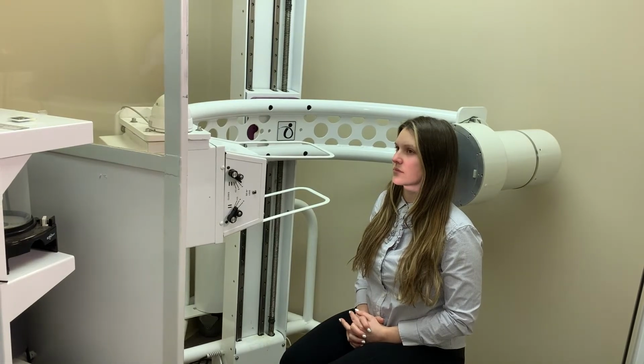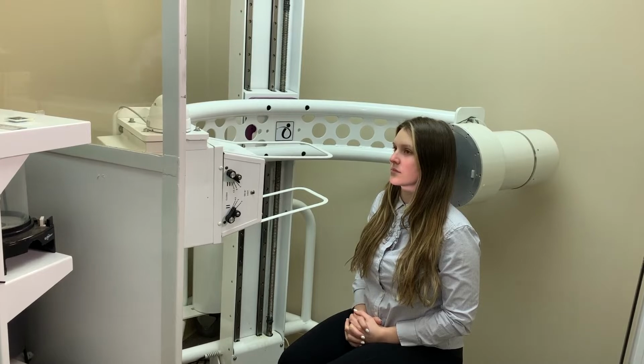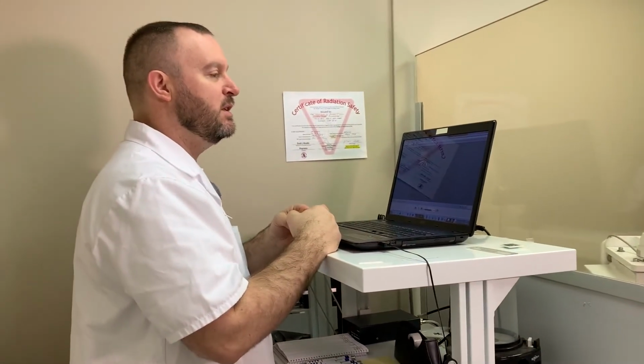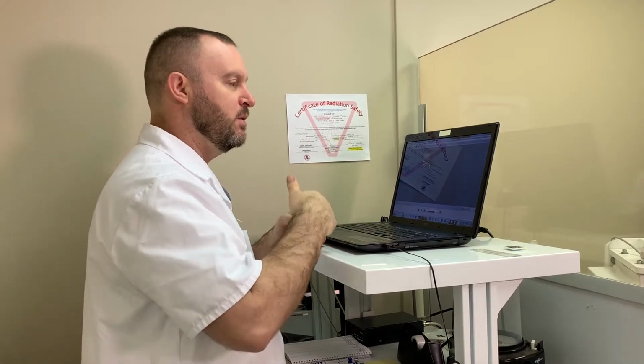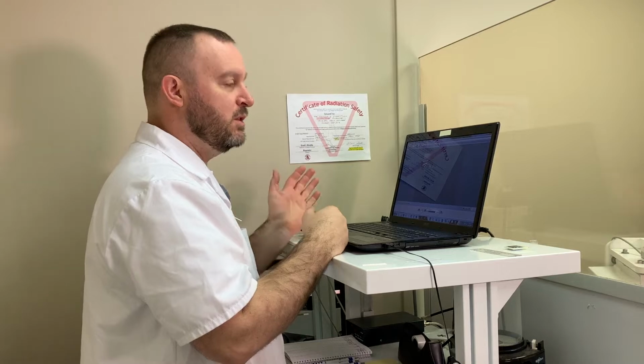So the first movement that you're going to do is going to be with your mouth open like you just had it, and I'll make sure that your positioning forward and back is correct so we're seeing the first 2 bones in your neck. From there you're going to basically tilt your head to the side, first to the left then to the right, and we're going to repeat that 2 or 3 times with your mouth open, and I'll talk you through it.